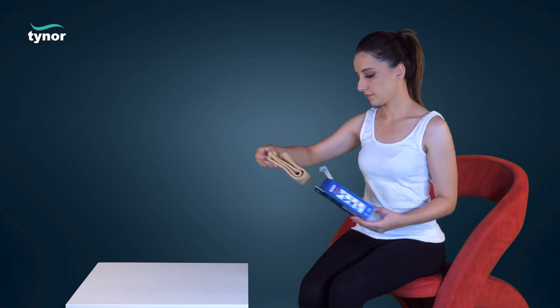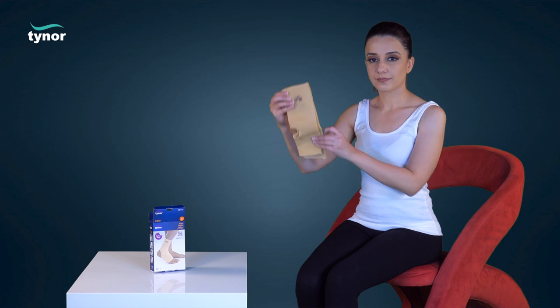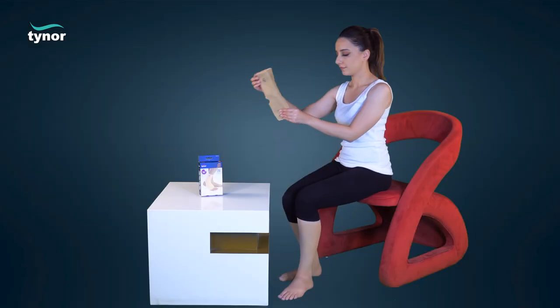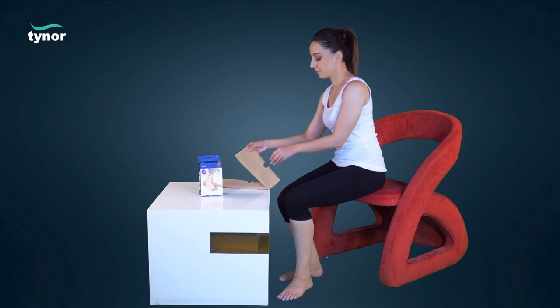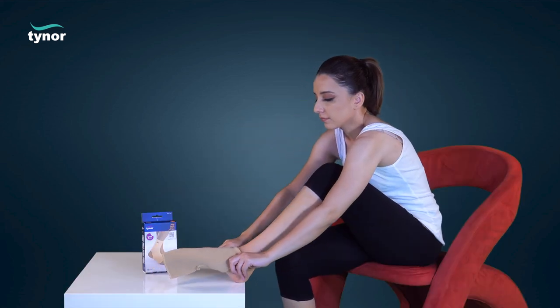The longer portion of the anklet pair should face upwards. It is worn by a simple pull-on action like socks.